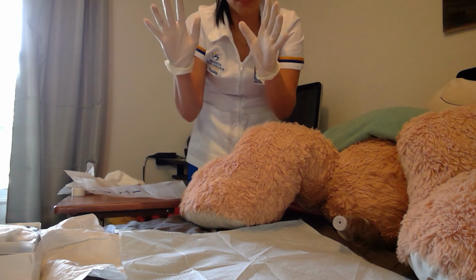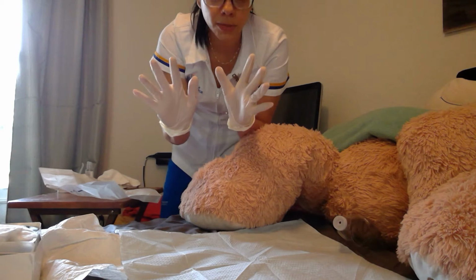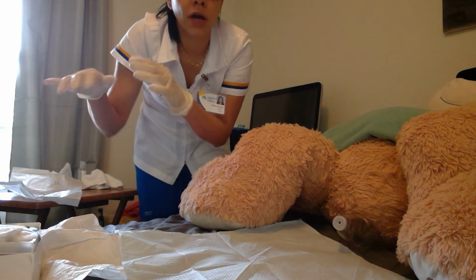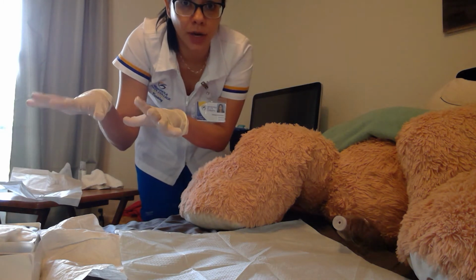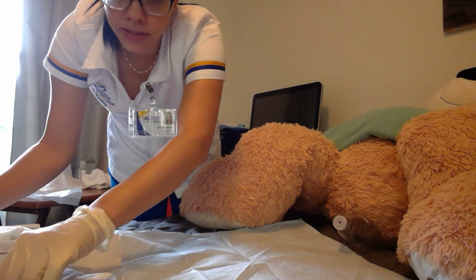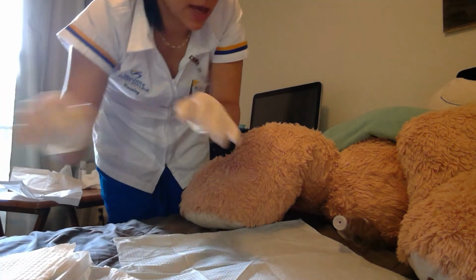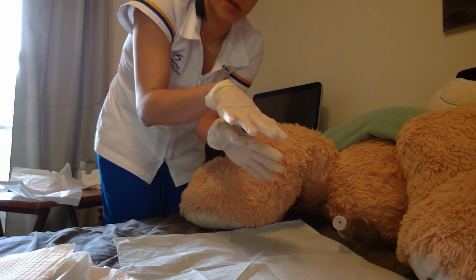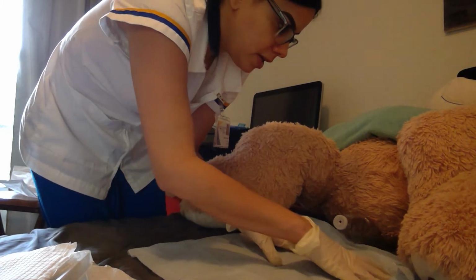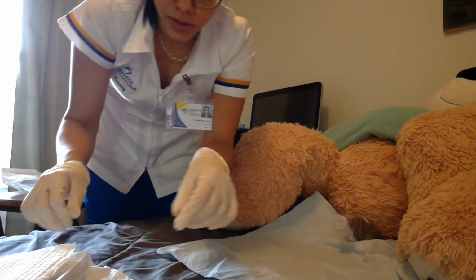Now I don't need this, so with my leg, I'm going to move my table, and now I realize my hands are sterile. I can touch the inside of my tray because that's sterile, and my hands are sterile as well. So now I can move this, move it. I can fix this, making sure that my gloves don't touch anything but my drape. I'm not touching the linens. I'm not touching anything. Just touching my sterile part.